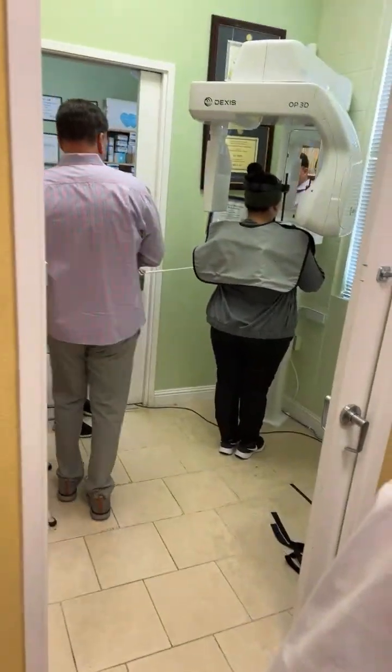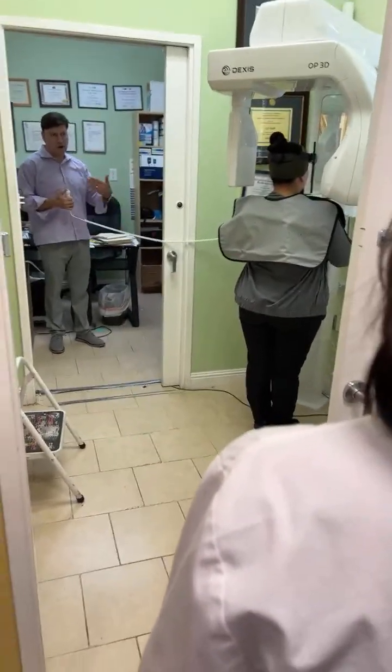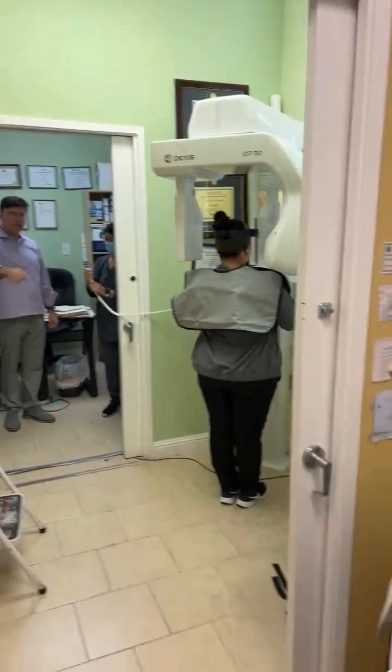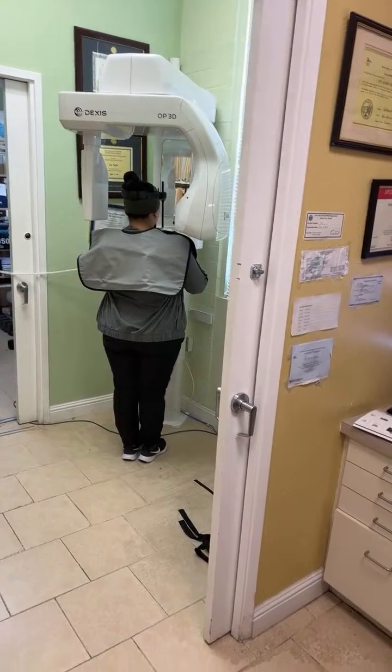Okay, so you could be standing right here, and this is fine. Come here, Ajit. He hasn't done it yet, so you can just stand right there. It should be okay. You guys are fine with it. You have to see the patient. Can't run and hide. Right. Hold it down and do not let go.